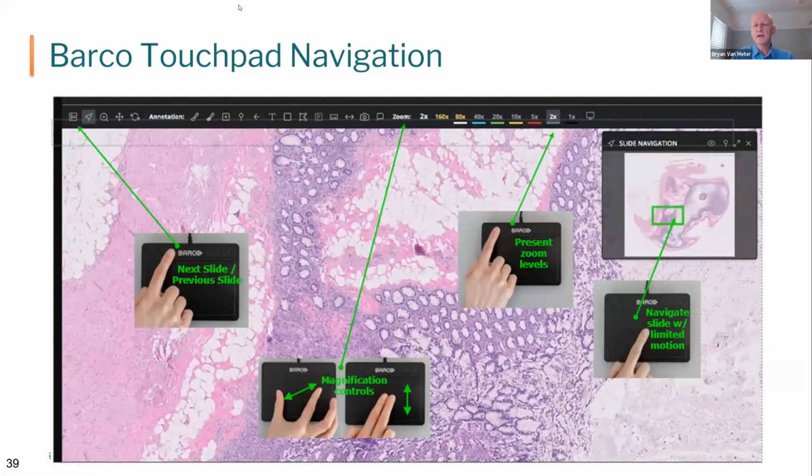So one of the things you'll find out as you get into digital pathology is that the mouse is not really adequate for most physicians. I know many pathologists who actually use 2 input devices at the same time, because there is so much image space that has to be scanned, and there are so many ergonomic worries. It's something that's going to be part of everybody's transition over to digital.